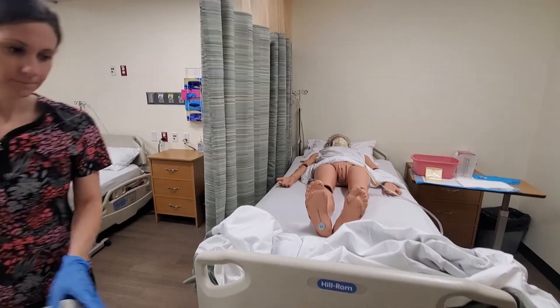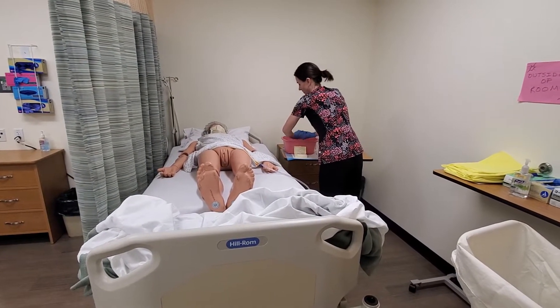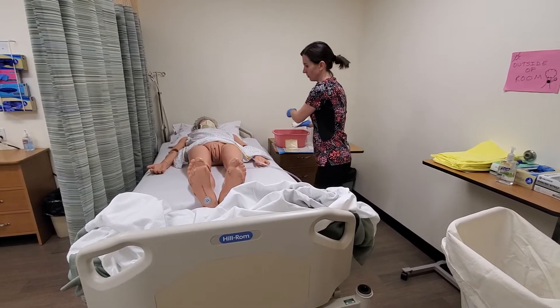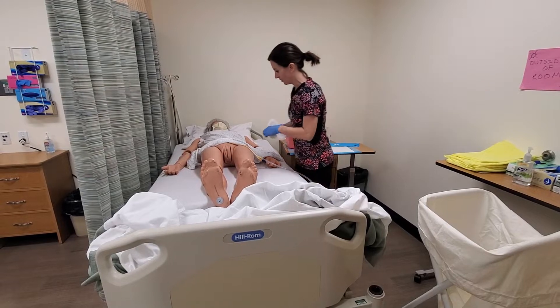I'm going to rinse in the same manner — gently hold where it exits the urethra and rinse three to four inches down without pulling at any time. Then I'm going to pat dry.